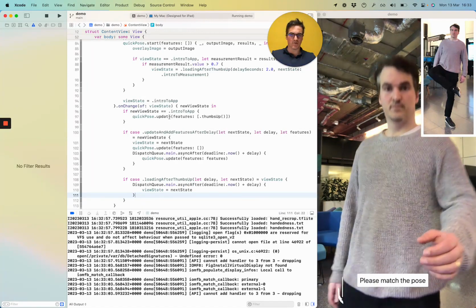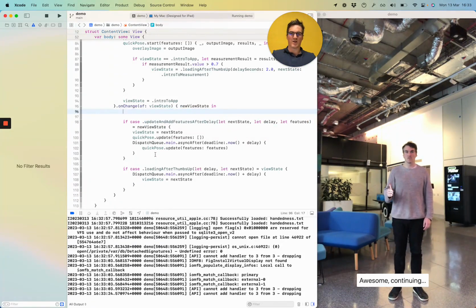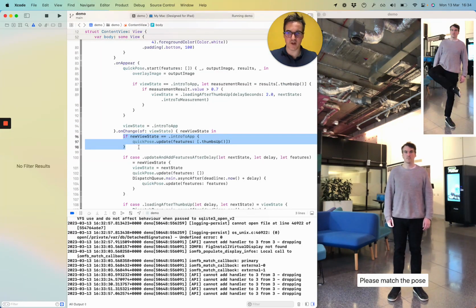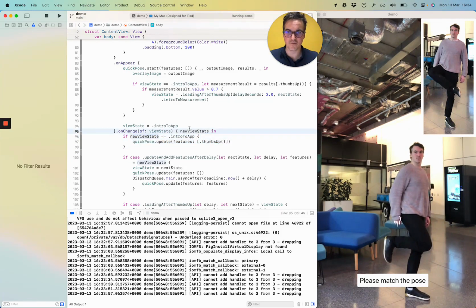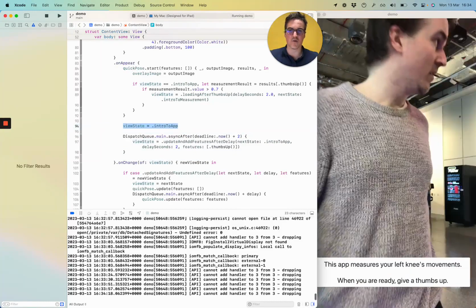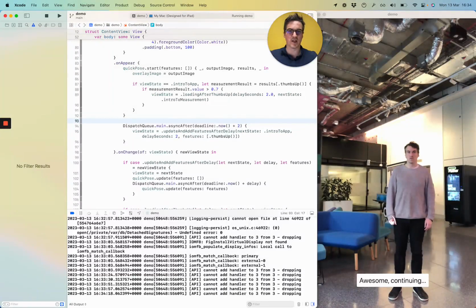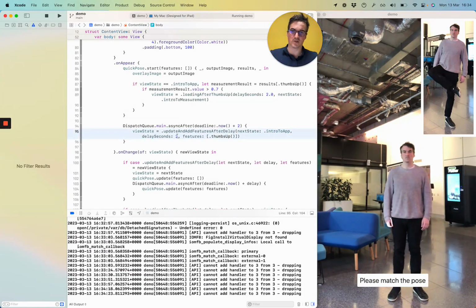We don't really want the thumbs up to be showing from the beginning. We only want the thumbs up to be showing after a certain delay. So how I'm going to do that, this is no longer sufficient because we're getting the thumbs up displayed all the time. So I'm going to remove that, and then I'm going to change the onAppear call so that when it appears, we wait 2 seconds, which I think is a nice enough time for the user to step back. We're going to change the state to intro to app. We're going to wait 2 seconds, and then we're going to allow the feature thumbs up to be shown.